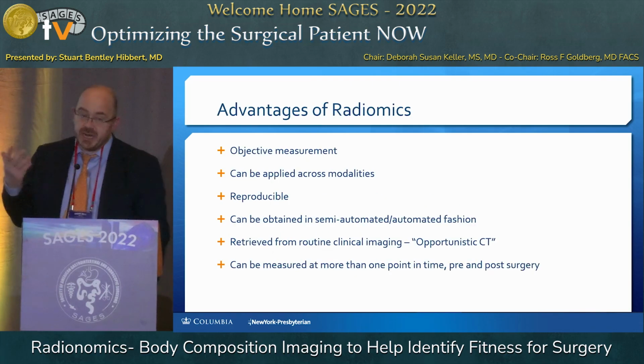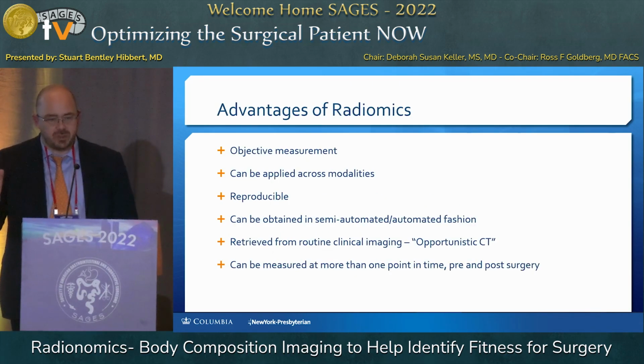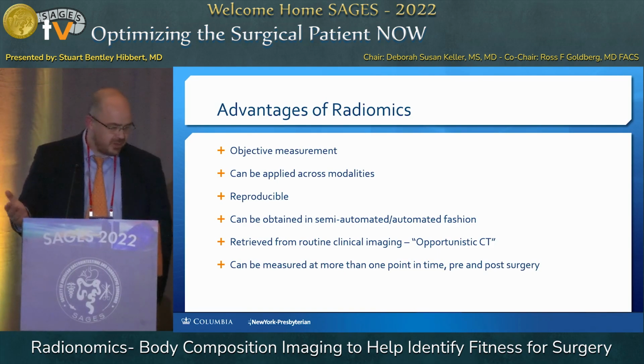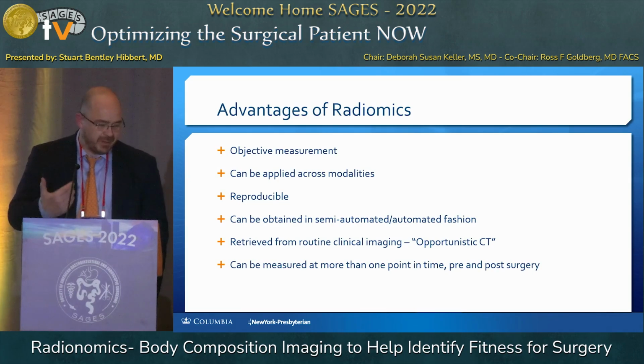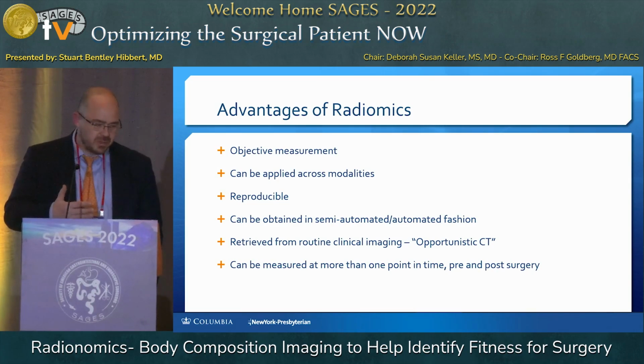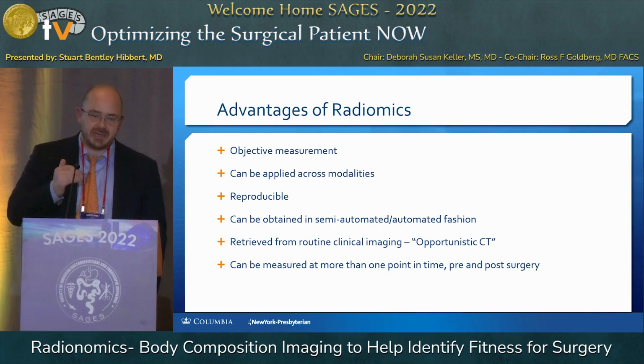So it is an objective measurement. It can be used across modalities. I'm going to focus mainly on CT. It's one of the workhorses, and we're dealing with surgeons, so you use CT, especially in body imaging, which is what I do. It's reproducible. It can be semi-automated, and we're moving to an automated manner, so we actually have to do nothing. And it's retrieved from routine clinical imaging.